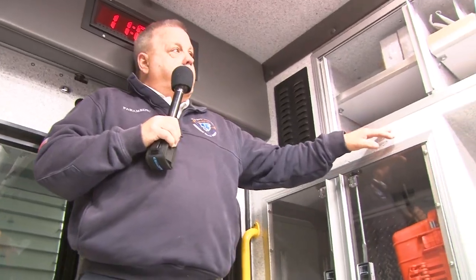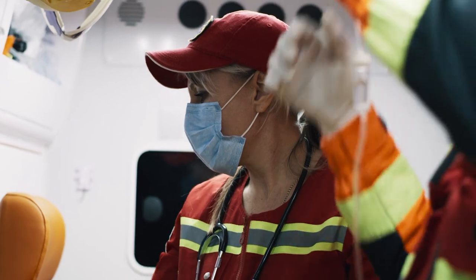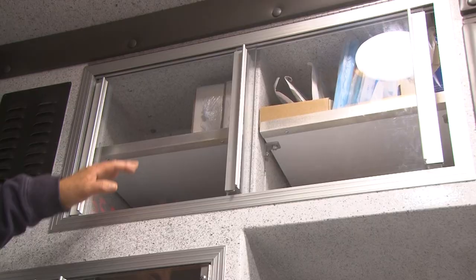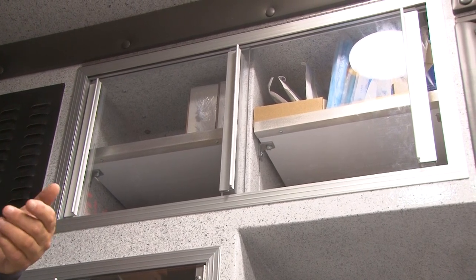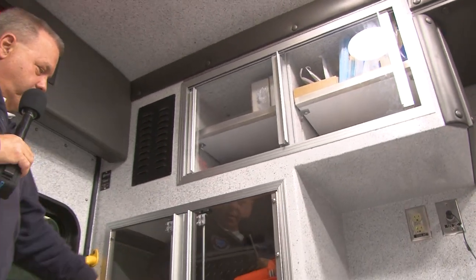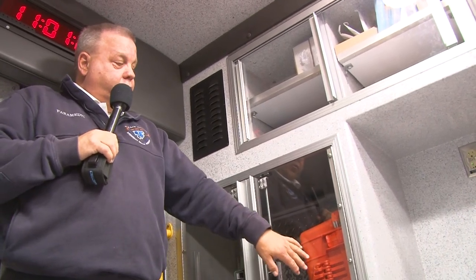So as we move to the rear of the patient compartment, we have some extra equipment here in the back. We kind of divide the compartments up into ALS, which is advanced life support, which is what we just looked at. And then we have some BLS, which is basic life support, over here. So the equipment that you'll find in these cabinets would be good for injuries or bandaging injuries, ice packs, trauma dressings, to be able to treat those types of patients. And then we have that outside compartment that we have access to inside here too. And Andrea has set up this orange box so they have some extra medication if they need it.